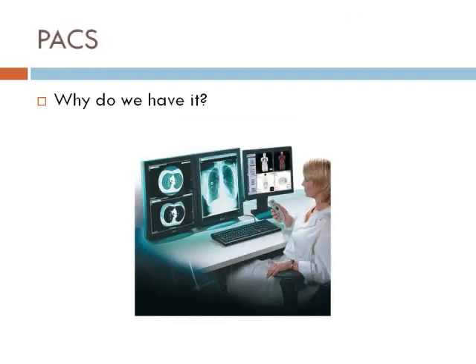So why do we have PACS? What was the need for it? It was faster, it's easier, it decreases the wait time to obtain X-ray results, and it allows instant access for the physicians, the nurses, the radiologists, and other healthcare professionals. They have instant access to the images from an X-ray. So it decreases that waiting time. It also allows a better and faster diagnosis for the patient who may be waiting in the ER before they can be discharged, or waiting on another floor in the unit until they can be discharged.